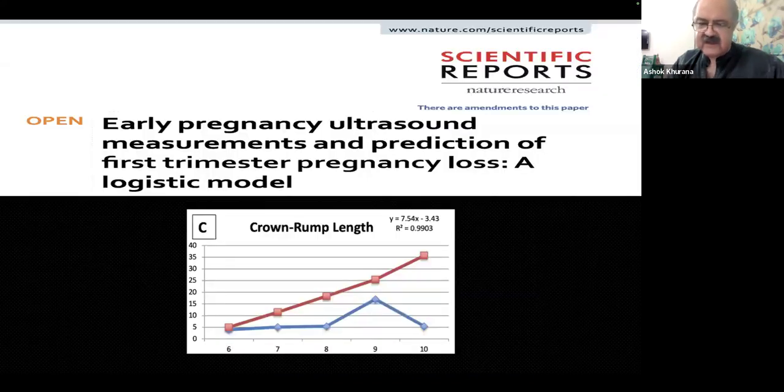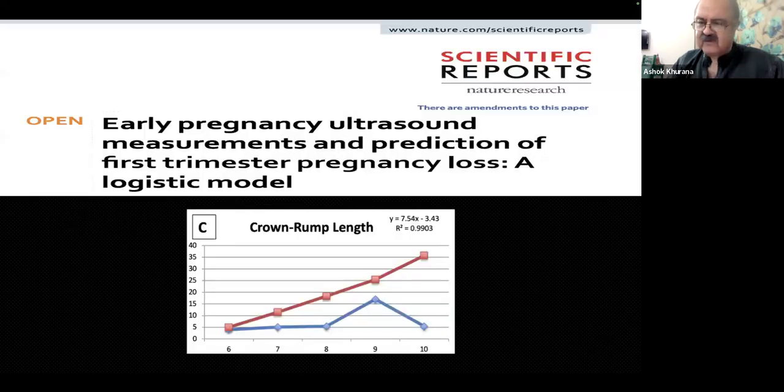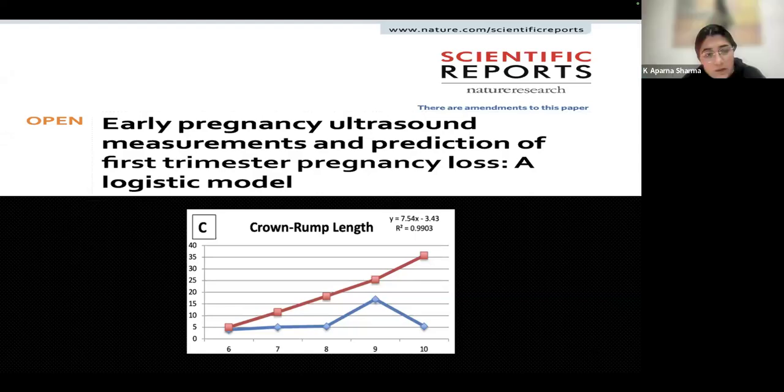We do understand that, yes, those could be markers of a poor prognosis, but these are in the so-called category of soft markers. And you could have perfectly beautiful pregnancies without the mathematics being in place. And therefore, we have to keep an open mind. Also, these definitions are based on a transvaginal scan and not on a transabdominal scan. And whenever we have a doubt, we must repeat the scan 2 or 1 week later, and no sooner than that, really.